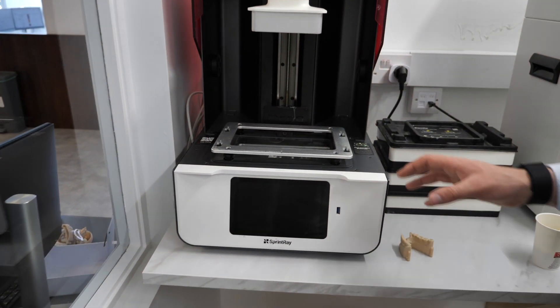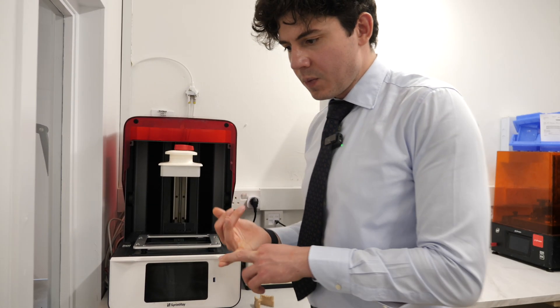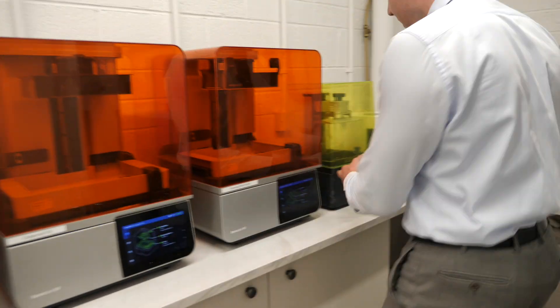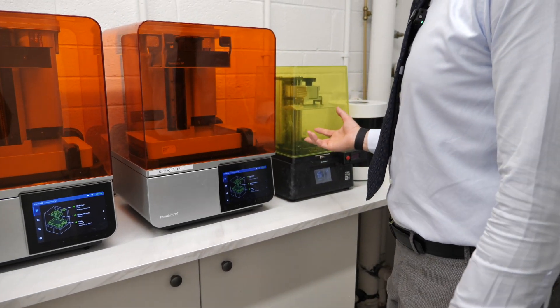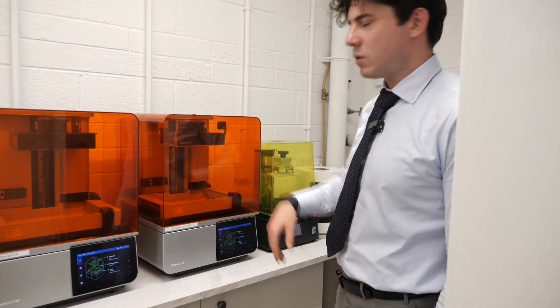Cheaper non-medical printers won't have inbuilt heaters, so you either have to heat the room or add on an external heater as we did here. In the early days we had about 20 of these, iterating different resins, calibrating, and playing around with various settings.